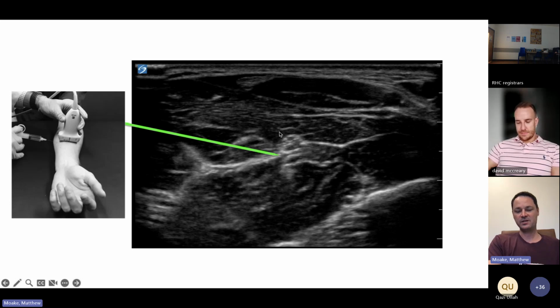The other key to keep in mind with these, when we're talking about specific, individual nerve blocks versus more of a plane block, is that we'll talk about putting anesthetic right near the nerve itself. In reality, all of these individual nerves are still sitting in those fascial planes. So with this nerve itself, you can kind of see this fascial plane between the muscle.